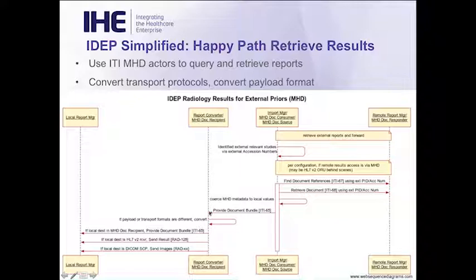So we haven't talked much at all yet about this report converter actor. The report converter actor is the actor which understands how to convert all of the reporting protocols as well as some of the report formats. It's still up in the air, I should say, we're still working through the details of determining exactly which report formats will be required and which ones will be named options so that products can differentiate themselves. To require everything, we're concerned, would just be overwhelming because there's a lot of different variables.